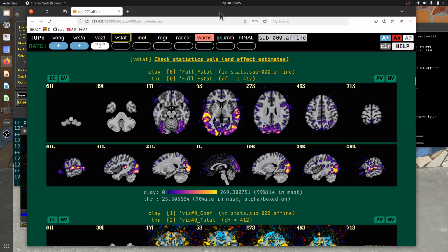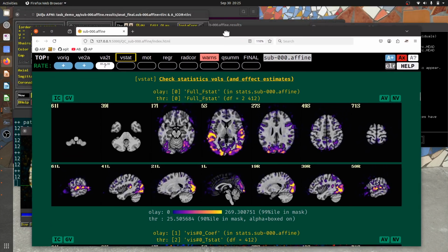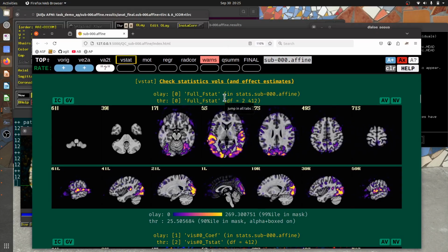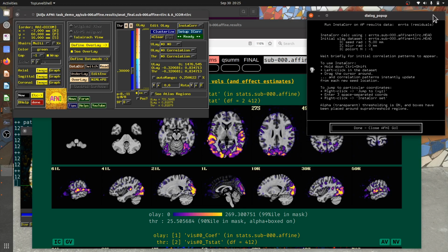But there are lots of things lurking in fMRI data that can mirror that, or that can add some kind of spatial relatedness and structure. And unfortunately, some of that could even be related to a particular task design. That gets into motion-related artifacts in particular, but even some scanner ones. Particularly for event-related designs, you have to be careful about this.